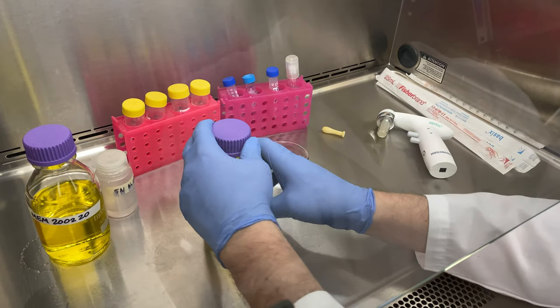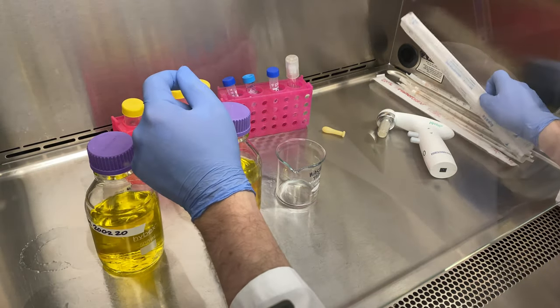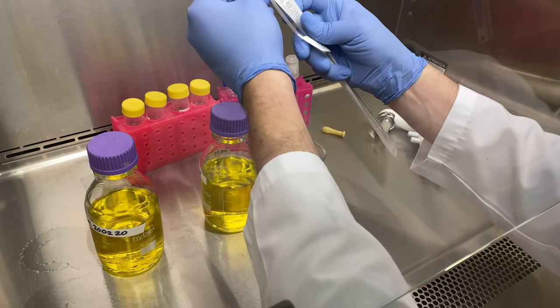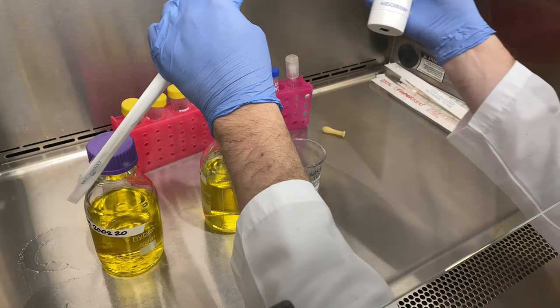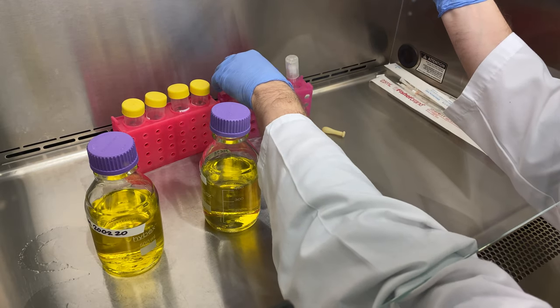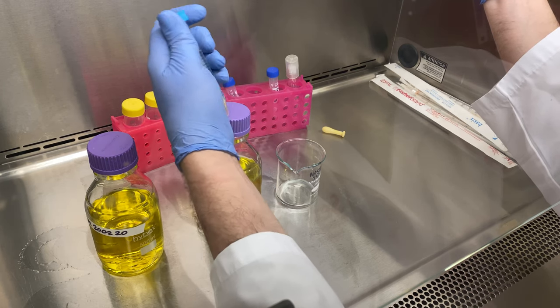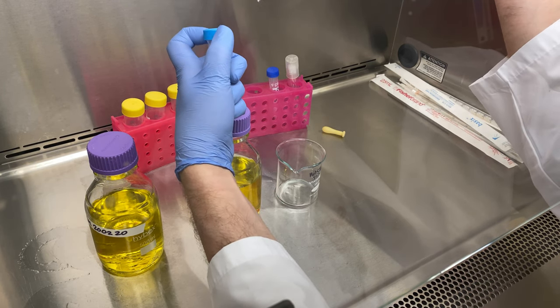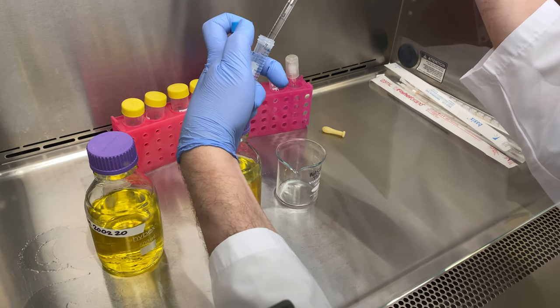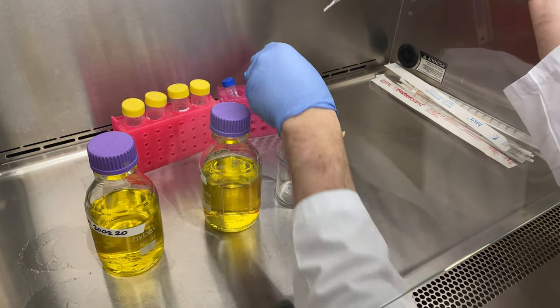Today we're going to finalize two bottles. The final volume will be 500 mils. In here we have about 480 milliliters of our solution. We'll start by adding a 5 mil pipet. Here we have sodium bicarbonate, 7.5% weight by volume. We're going to add 2.5 mils of our 7.5% sodium bicarbonate to each of these containers.